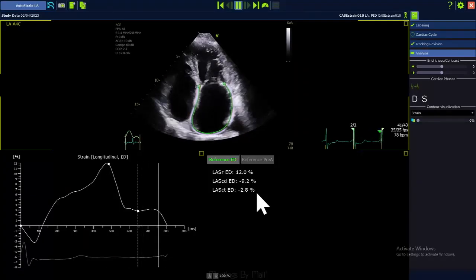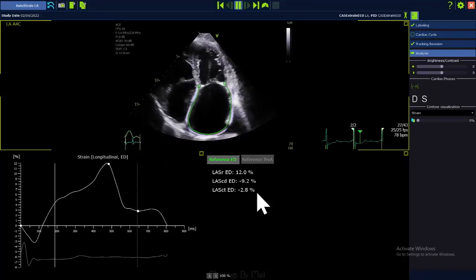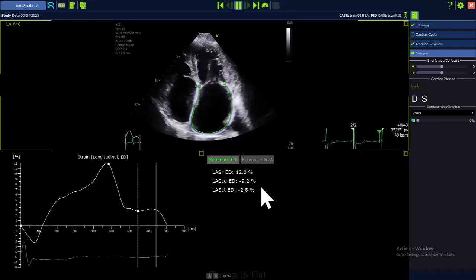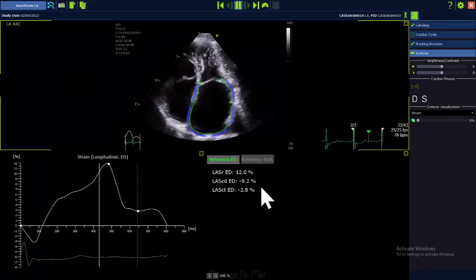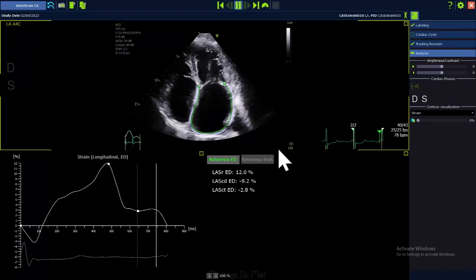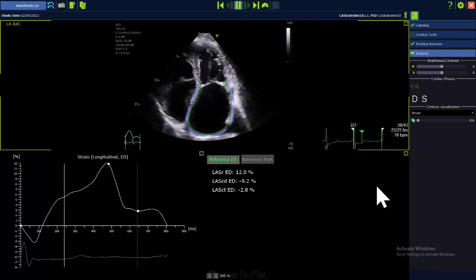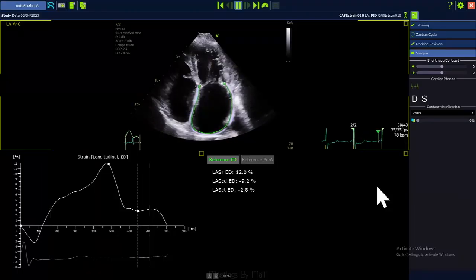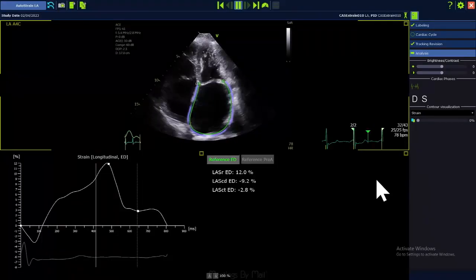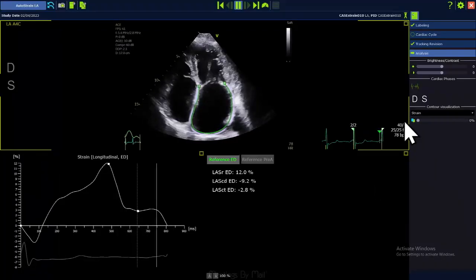This is also very useful looking at LA after an ablation. After a maze procedure, even after a conversion, this may be useful as well. So I think this is going to be more common. Many things affect this as well, like anything else in cardiology, mitral regurgitation, etc. But very good. Okay. All right, thanks.